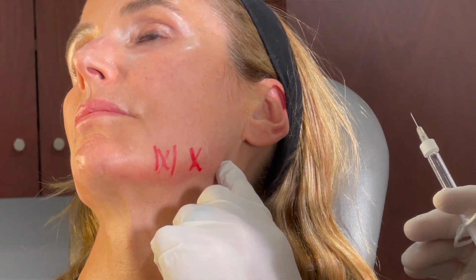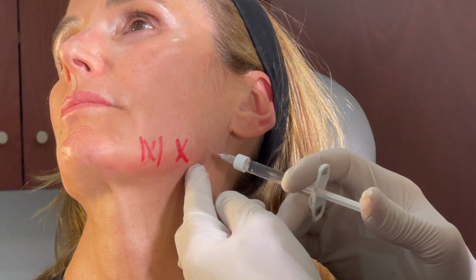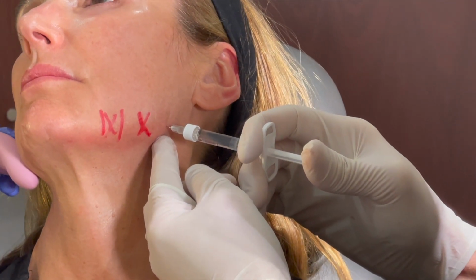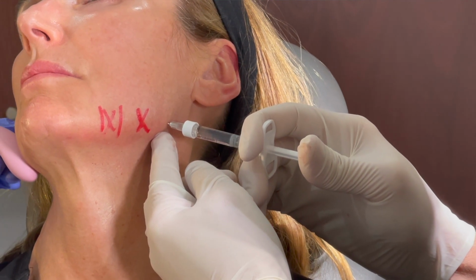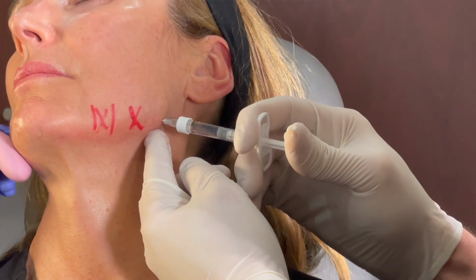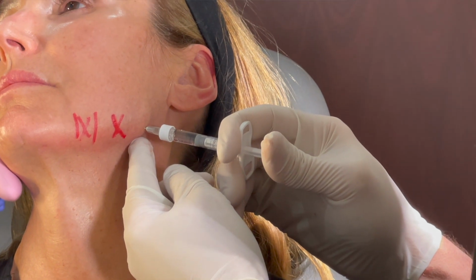So first I'm going to inject onto the periosteum in the gonial angle area. This is a rather safe area. I go down on the periosteum and inject a bolus of 0.5 cc. What this does is enhance the gonial angle, and it gives that retromandibular fossa, that shadowing that is attractive.